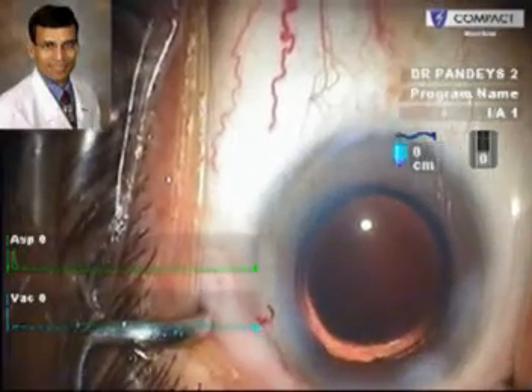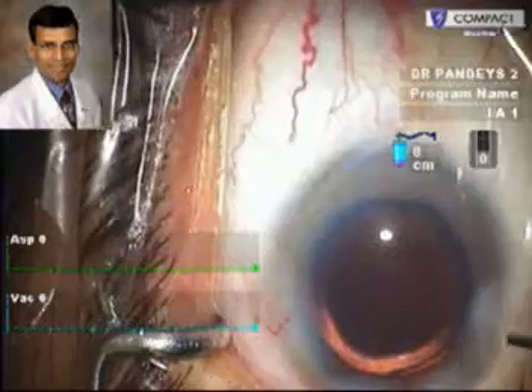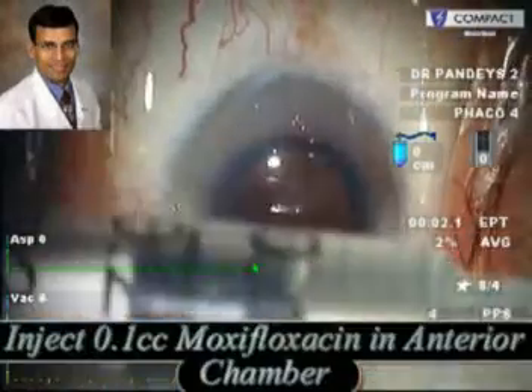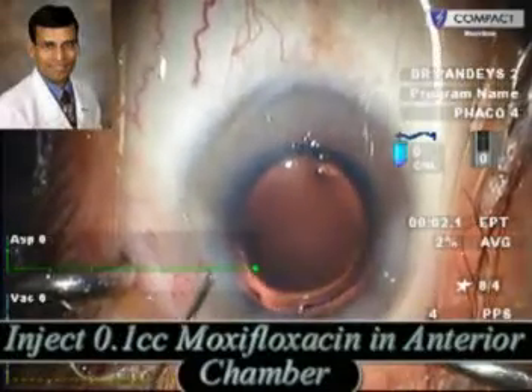As you can see here, the IOL is in the capsular bag and is extremely well centred. This is the end of the surgery with sealing of the incisions using BSS, and at the end an intracameral injection of moxifloxacin into the anterior chamber.